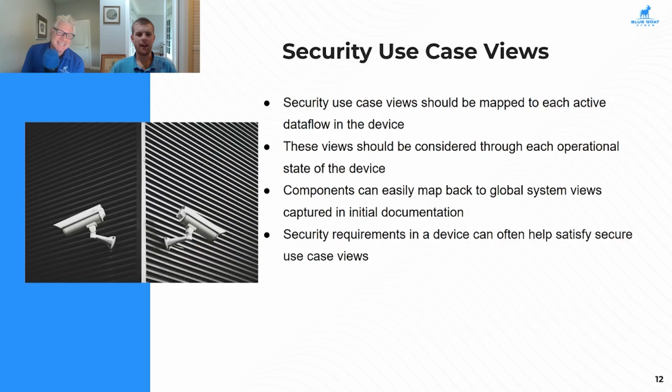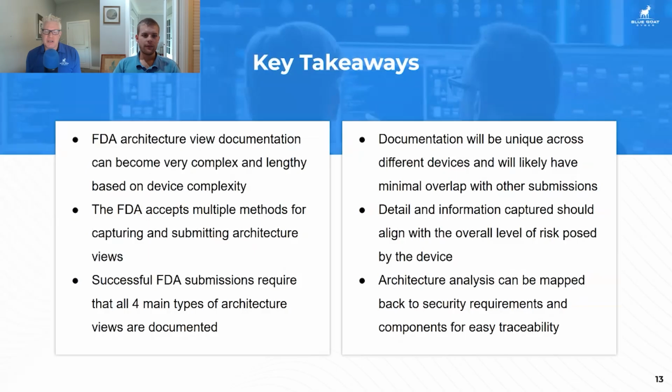Like, we can go back to the updatability and patchability considerations. True. Our device should verify the update package pushed out by our update infrastructure. We control every component. We control the data flow. We still need to verify that it's secure. So in that case, we may need to make sure that that patch is digitally signed with our certificate. Exactly. Yeah, that's a great example of how we can make sure that something is secure through a data flow transfer. I guess that's true. We don't even trust ourselves, do we? Exactly. Zero trust applies to us as well.